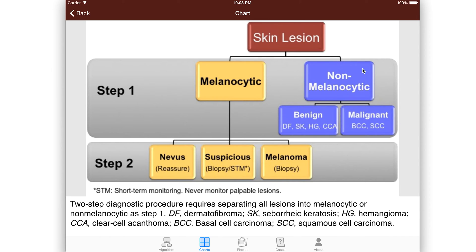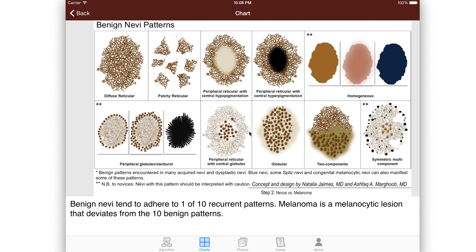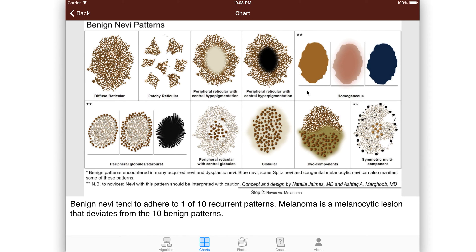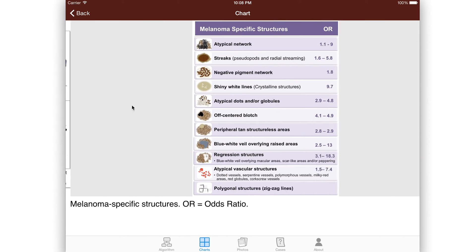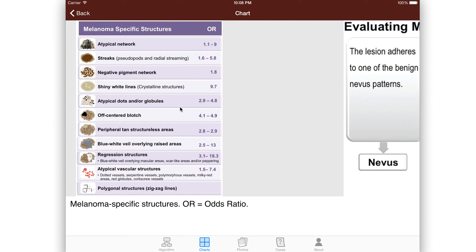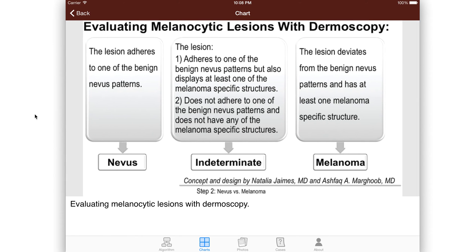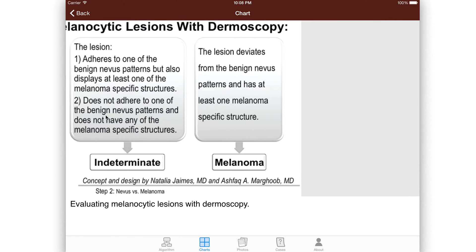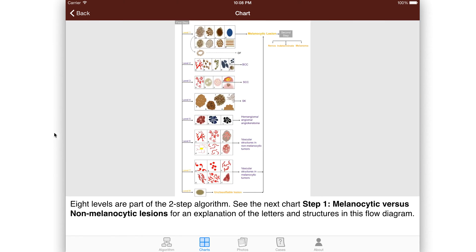If it did turn out to be non-melanocytic, then there are some other diagnoses we might find that are either benign or malignant. We can go through all of these charts. We've got charts for benign nevi patterns, the melanoma-specific structures, and then there are some other charts as well.